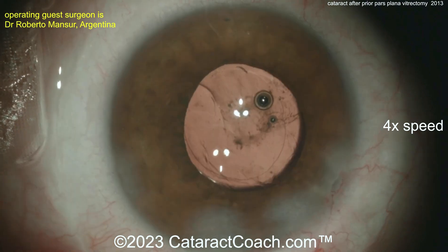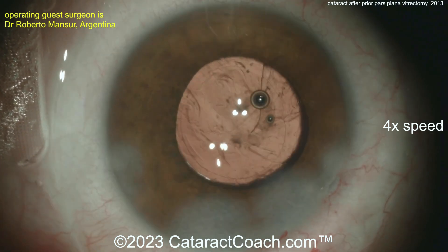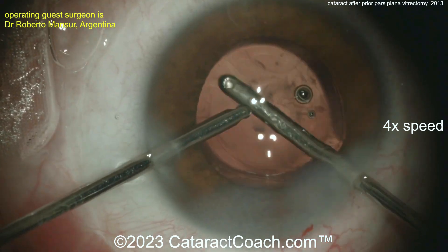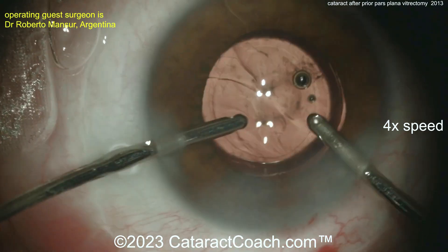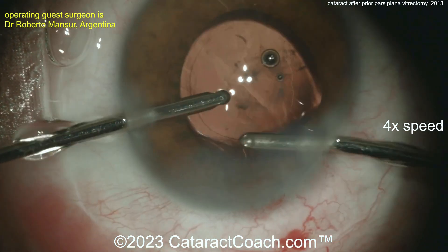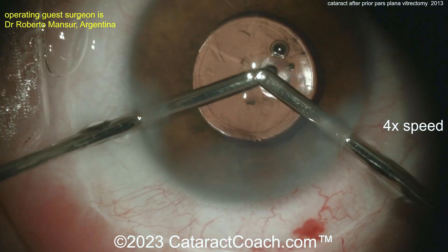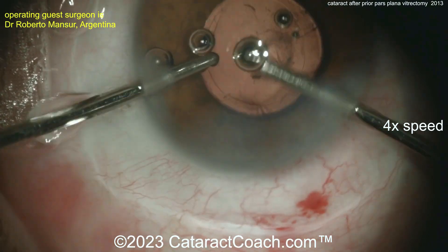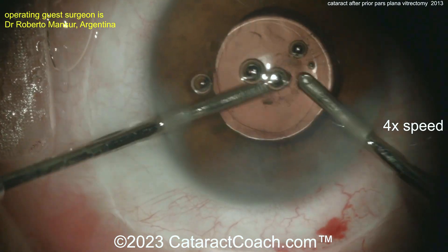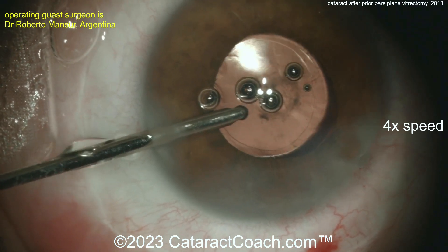If you have a patient like this with damage to the posterior capsule, you've got to treat these patients differently. If you go too forcefully and do a big hydrodissection, you may get a break in that posterior capsule. A lot of patients are having a tremendous number of intravitreal injections prior to cataract surgery for diabetic issues, macular degeneration, or vein occlusion — and those patients you have to be careful with as well, because there can be iatrogenic damage to the posterior capsule. Look very carefully at the red reflex on these patients prior to booking them for cataract surgery so you know what to expect. This patient has a very nice outcome, and again you can do a YAG laser capsulotomy at a later date. Nice case — thank you for submitting it.